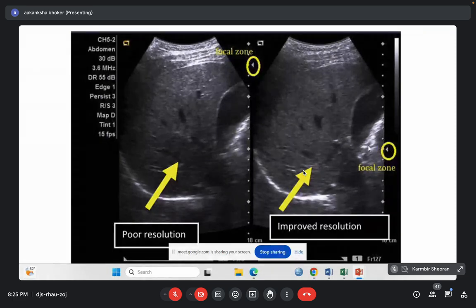So only till the region of interest we have to make sure कि हम इसको focal zone को लेके आए. Suppose हम सोचते हैं कि हमें यहाँ तक देखना है, ठीक है, अगर हम unnecessarily यहाँ से हटा के और नीचे focal spot को ले जाएंगे then PRF will reduce. So we have to place the focal zone at the area of interest.